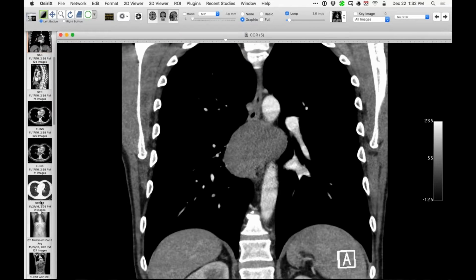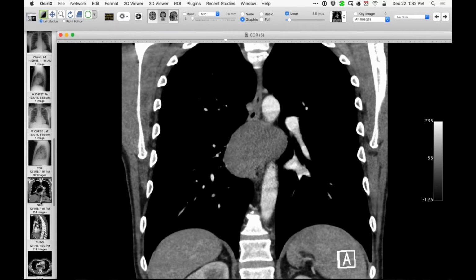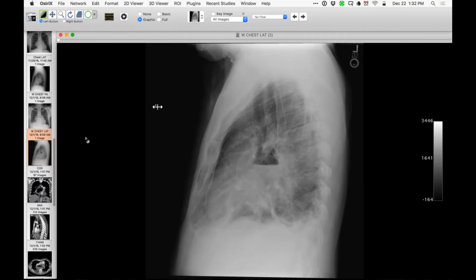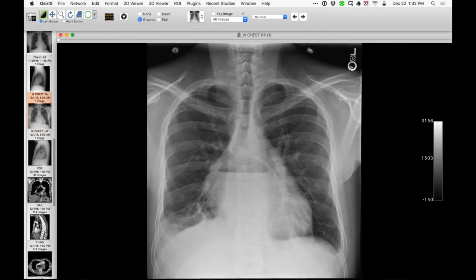Yeah. Obviously, when we initially got to see the case here and thought about it, this was a big wow when we saw that fluid level and ostensibly a solid mass, right? That was scary. So that's a gotcha. That's a watch out.